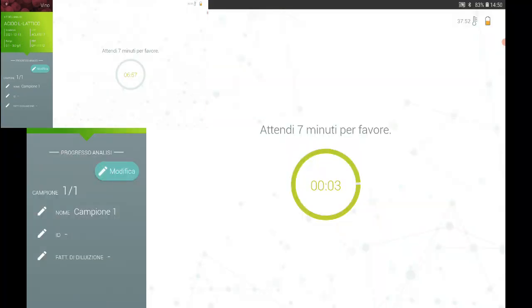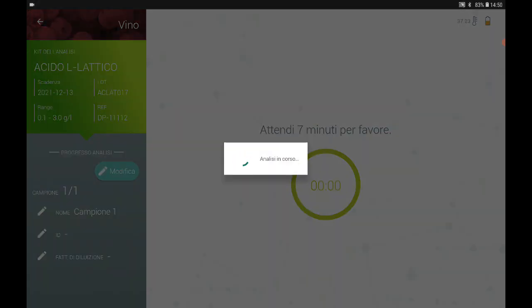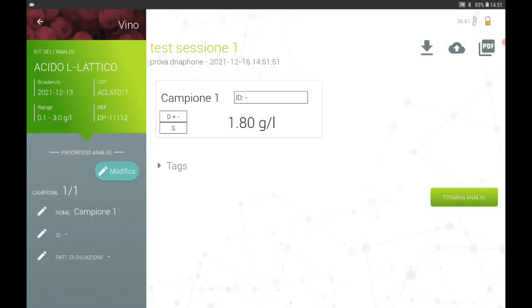Once the waiting time is over the application automatically reads the sample and returns the result, which you can see on the summary screen. If you have set up several samples, you can start reading the second sample immediately from here. If you have finished all the samples, you can end the analysis. In the final screen you already have the possibility to download and share the results in different formats.